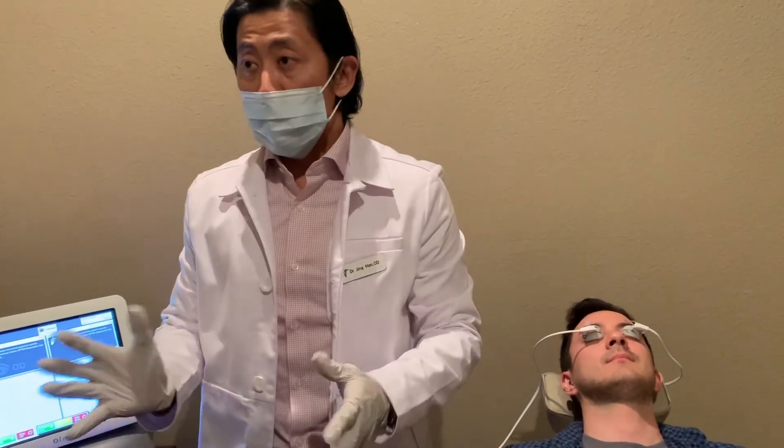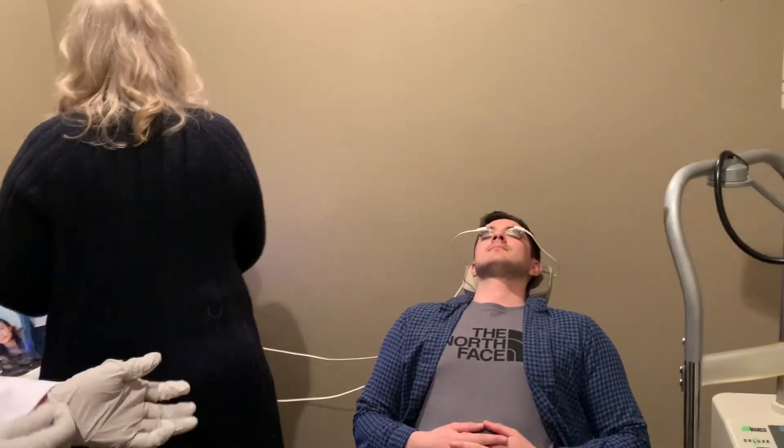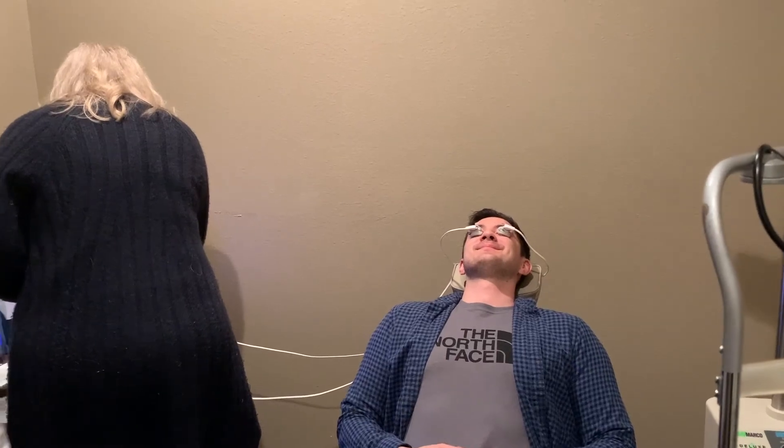I'm going to have Rachel now go ahead and push the start button and kind of talk you through it. She'll be able to remove it after about 15 minutes. But that's it. Are you comfortable? I'm great. Awesome. Well good. We'll see you in about 15 minutes.